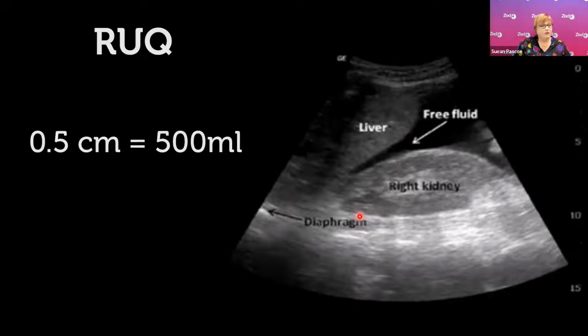And so, as I said, if you find fluid in the pelvis, then we're going up to the right upper quadrant. This suddenly becomes a bit of a hurry getting you to theatre rather than worrying about trying to find the ectopic.